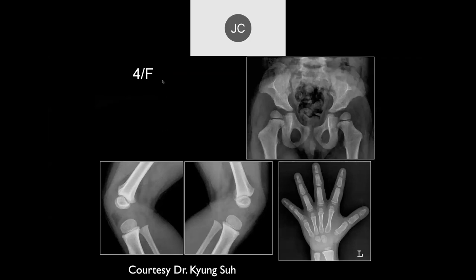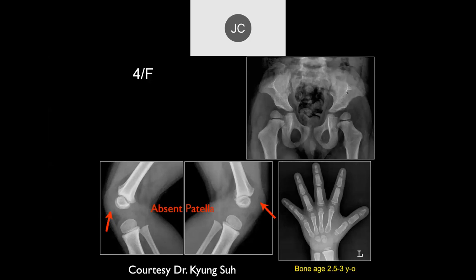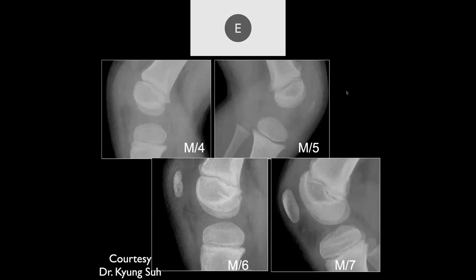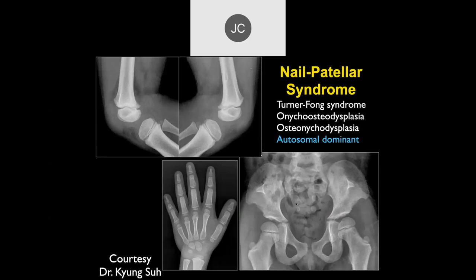This is a four-year-old female. The bone age is more than a year younger — delayed bone development. There's no ossification of the patella yet at age four, and there are iliac horns. This is nail-patella syndrome, which has several different names. It's an autosomal dominant condition.